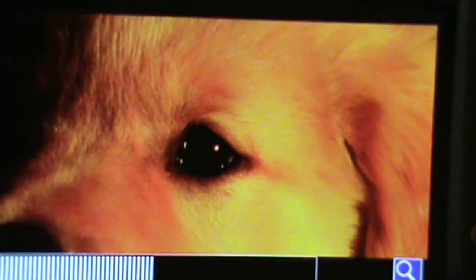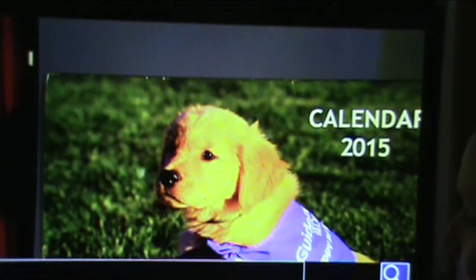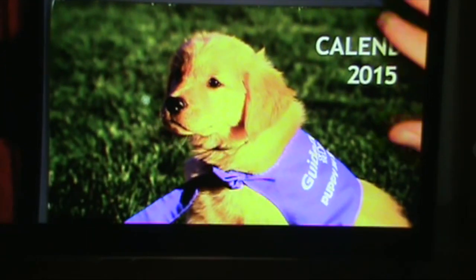We're going right in, and you can kind of see that we're actually getting the dots of the page. In fact, my hands, I probably should let go because now, oh, there we go. You can kind of see the dot pattern in the page, and that's at a level that the system is actually able to see the paper, and we're looking at the ink dots now. So we'll bring this back down again.